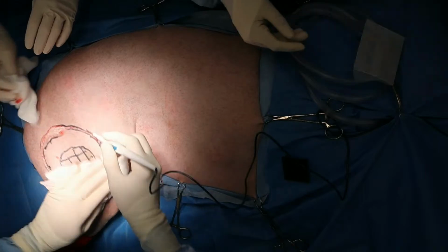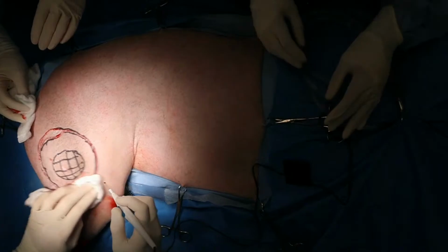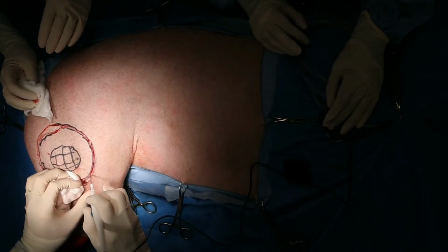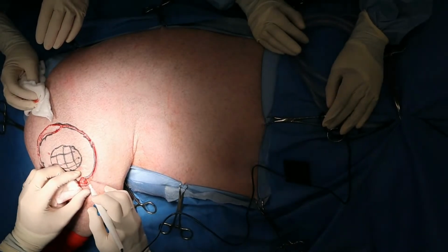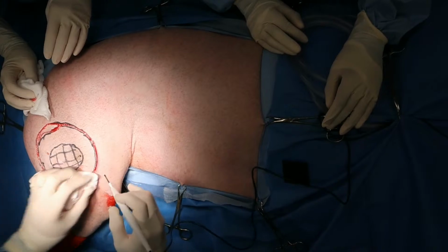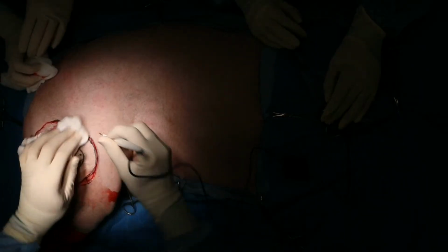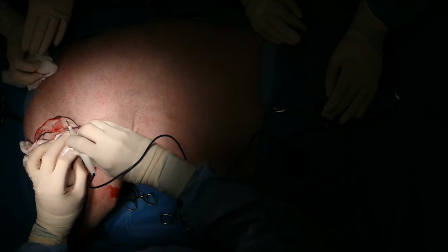Realize you have to take the muscle with the fascia. Yeah, so you need to get a muscle fascia. And the problem is that with the biceps muscle, it's hard to separate the fascia out from the muscle without actually taking partial thickness. Like anywhere else, like on the antebrachium of dogs, you can take that antebrachial fascia without taking the muscle, but on the lateral thigh, you can't, because the fascia is so closely adhered.